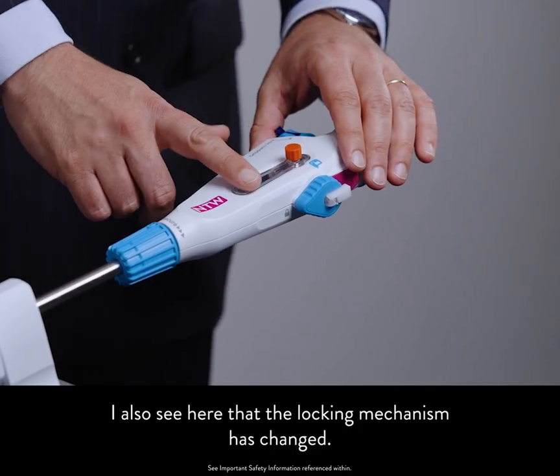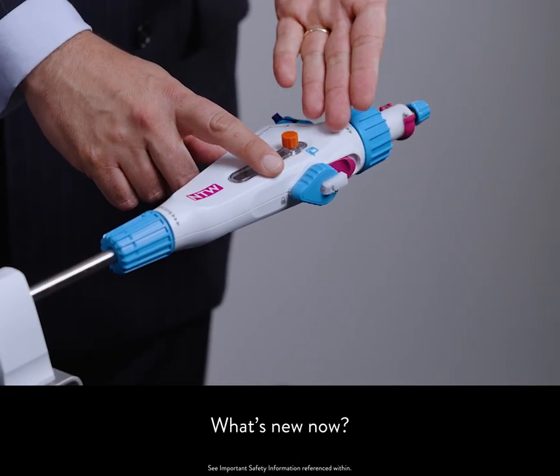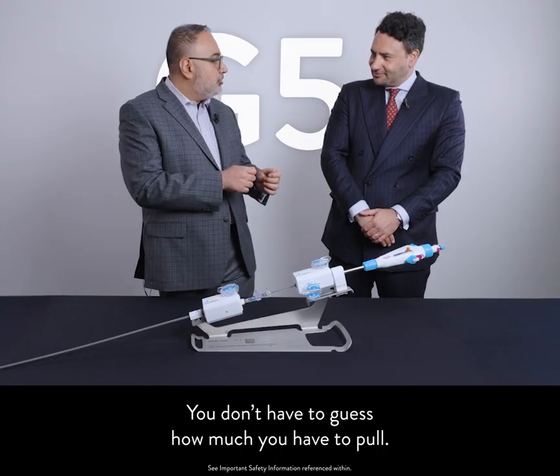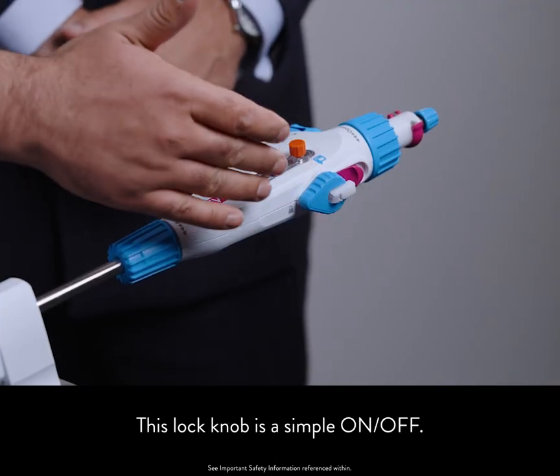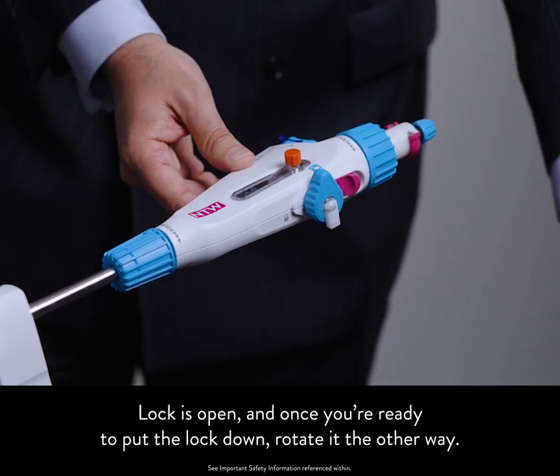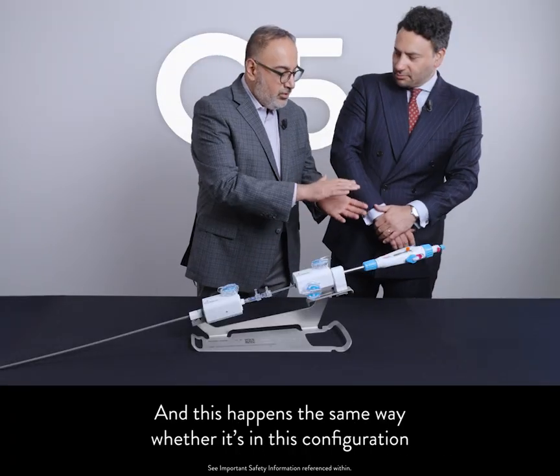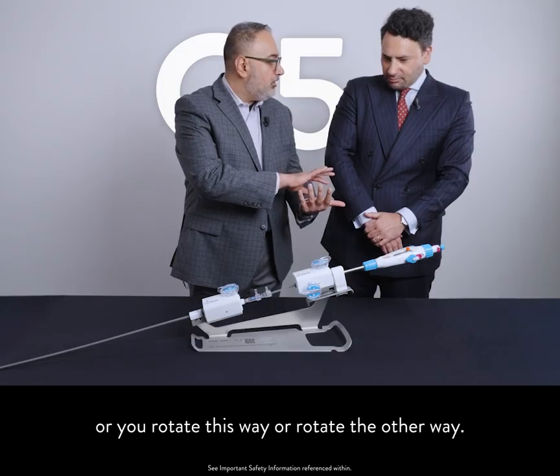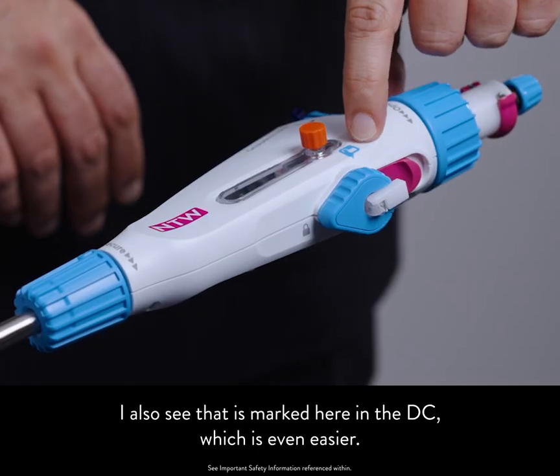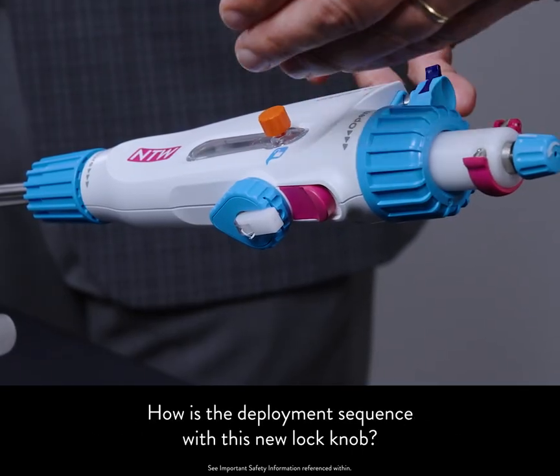The locking mechanism has also changed — we don't have that lock lever anymore that you have to pull. There's no more blue line, no more plastic lever, you don't have to guess how much you have to pull. This lock knob is a simple on-off. Rotate it up and the lock is open. Once you're ready to put the lock down, rotate it the other way. This works the same way whether it's in this configuration, rotated this way or rotated the other way — very easy. Now you don't have to even look at it.